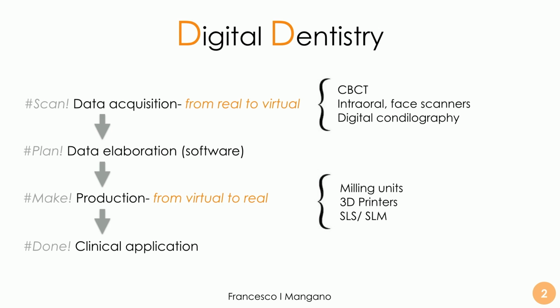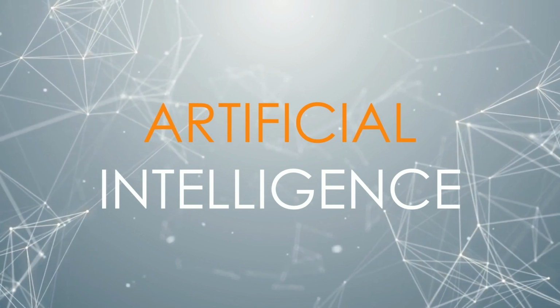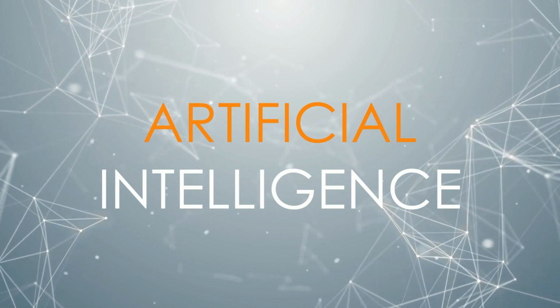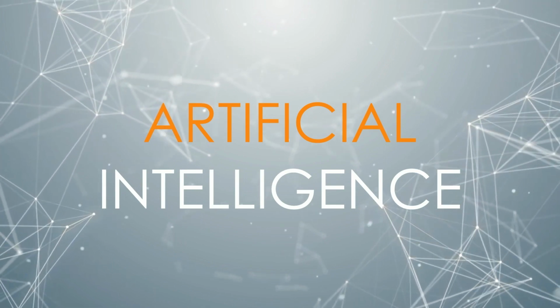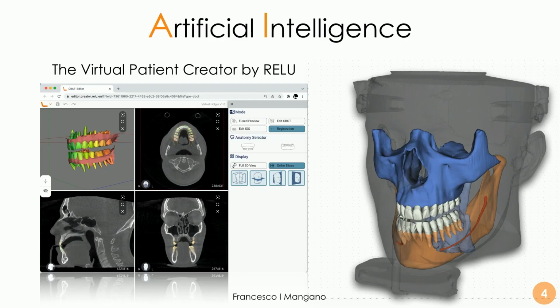Let's talk a little bit about artificial intelligence, a totally new field in dentistry, a very fascinating field. You can read a very interesting article from the group of Professor Reinhilde Jacobs, published in the journal I have the honor to edit, the Journal of Dentistry by Elsevier. And we are talking exactly about the same product, a software called Relu with the Virtual Patient Creator, a very valuable tool to create a virtual patient and to merge all the information of the patient within a single project for our planning purposes.